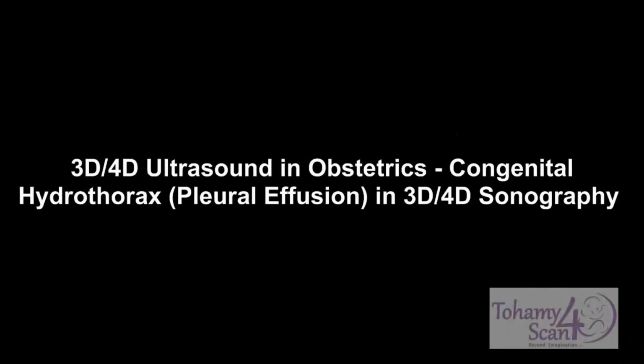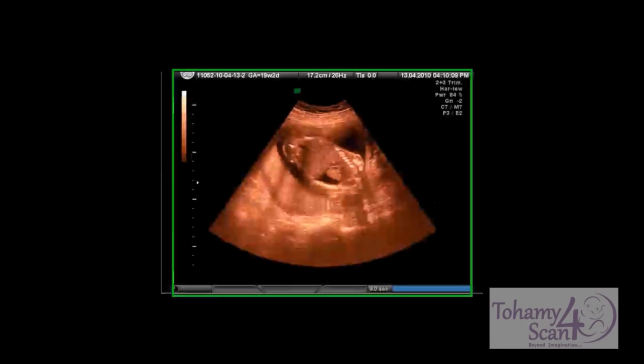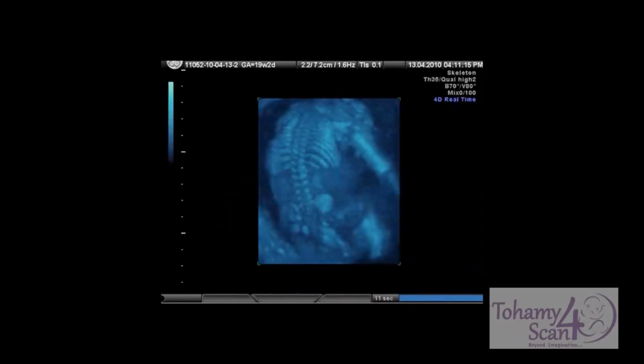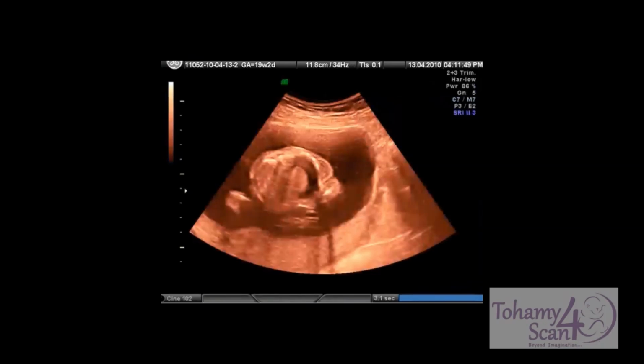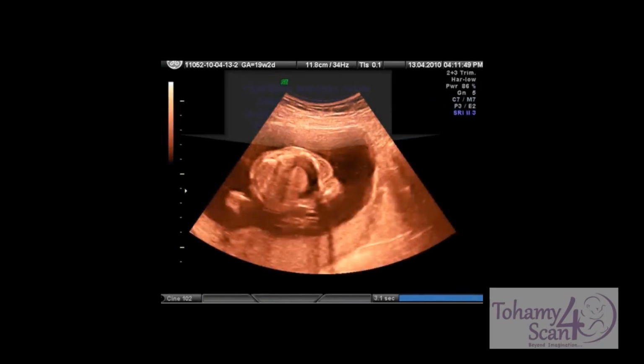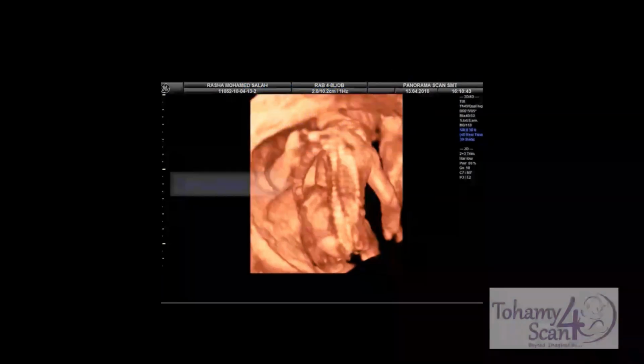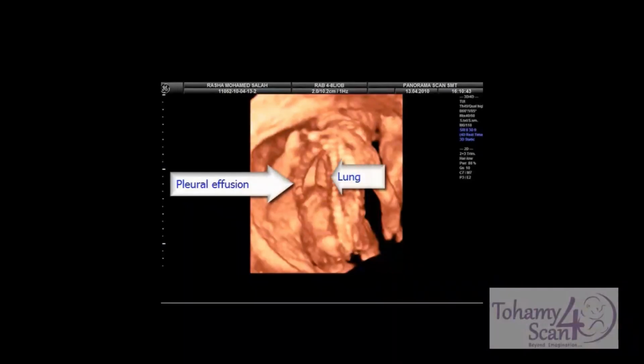Now we have a special video prepared for you that will provide a deeper understanding of fetal hydrothorax. This video will give you an up-close look at how the condition presents on ultrasound, including key features to help with diagnosis. We encourage you to pay close attention to the images and explanations, as this will give you valuable insights that will support your learning. Please watch carefully, and we will discuss the key takeaways right after the video.